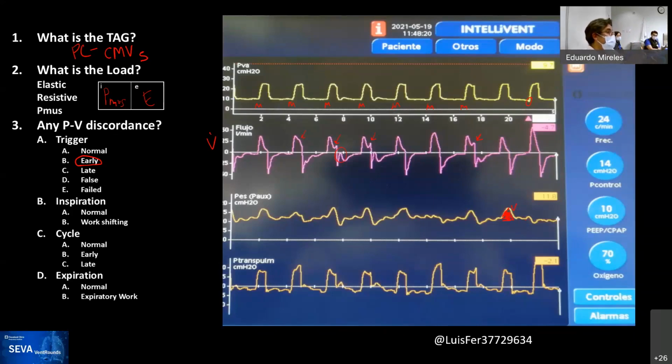I think that there are things that facilitate it from occurring. And there are two different types. There's the one where you can drop the rate and it will continue to occur, that it's kind of a reflex state. And there are others in which, as you go down, the natural rate of the patient takes over and it goes away, right?